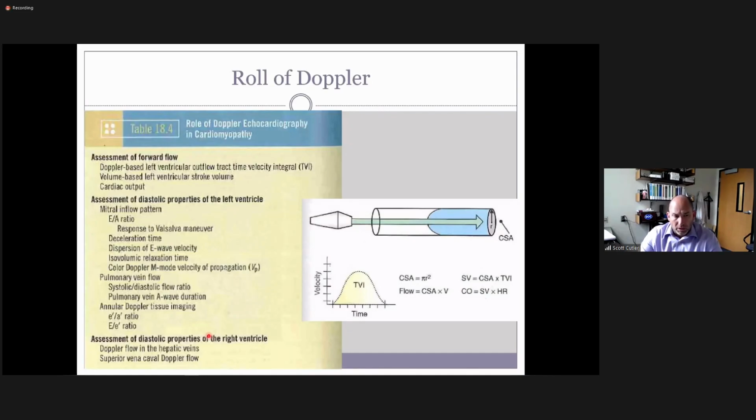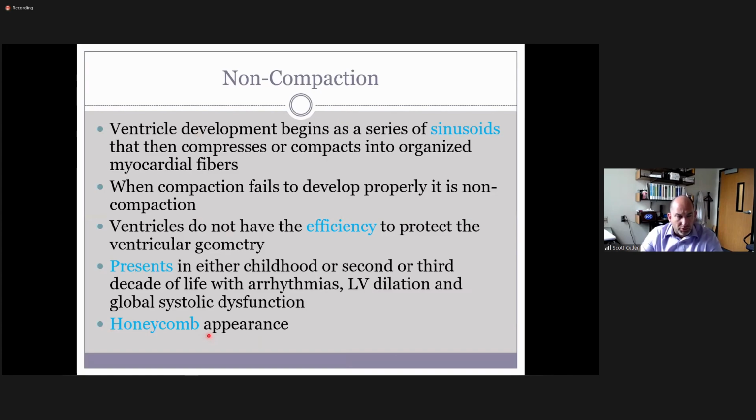If I was doing a transesophageal echo, depending on how you're approaching it, you could end up with one above the baseline. It just depends on where you transducer it. Remember that. But from our transthoracic perspective, that's not likely to happen.